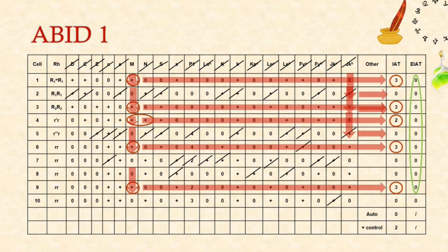And then just to avoid me getting repetitive strain injury from clicking the mouse several times, I've just sort of pre-done all of these exclusions. So for anyone who hasn't had a chance yet, just take it that these are okay, because otherwise we'd spend 1 hour doing one antibody ID. Then we're going to move on. We've got to the point we've done this where we've got to M. I'm going to move down, then I'm going to move along.